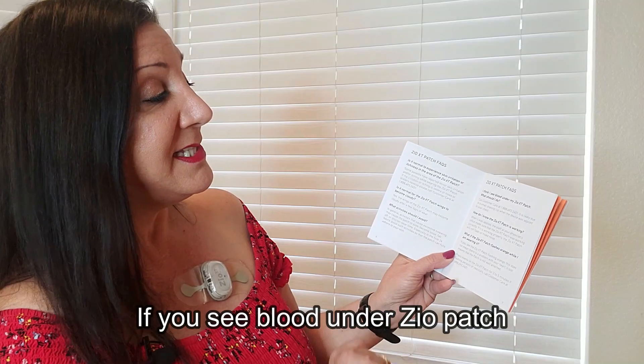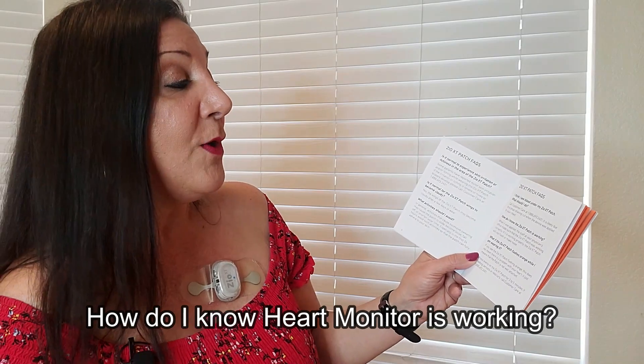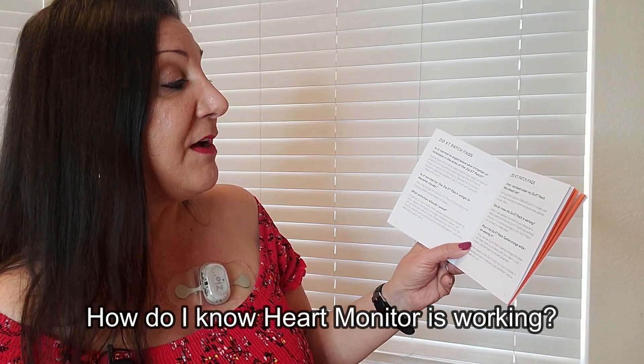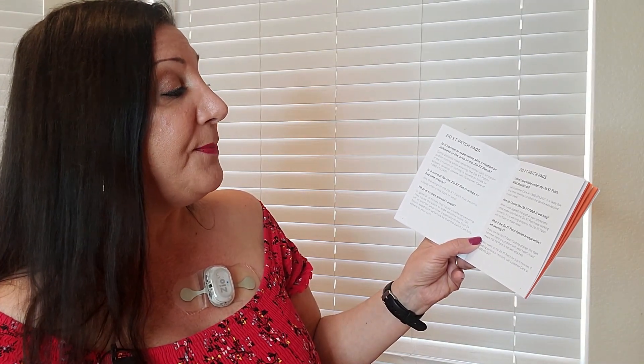If you think you see blood under your Zio XT patch, call customer care at 1-888-693-2401. It is likely due to a small shaving cut when the device was applied, especially if you're male. How do you know the Zio XT patch is working? When it was applied, the staff at your physician's office verified it was working. If it is working properly, it will not flash or make any noise — just have faith and push the button any time you feel symptoms.